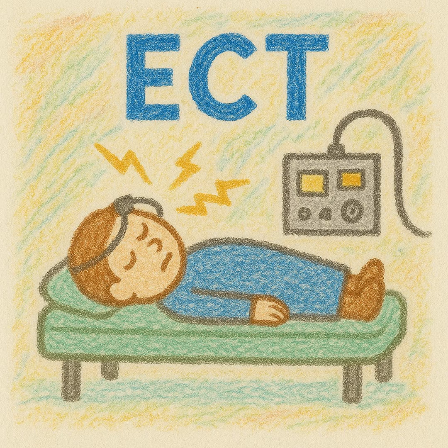So if you're on the inpatient setting and you're doing ECT, oftentimes we'll elect to do bitemporal because we're trying to move things along faster. These are inpatient cases by definition. They tend to be higher acuity, et cetera. If someone is particularly concerned with the memory side effects, right unilateral, especially ultra brief right unilateral treatment, is associated with significantly fewer cognitive side effects. But again, it might take longer to get the same efficacy.